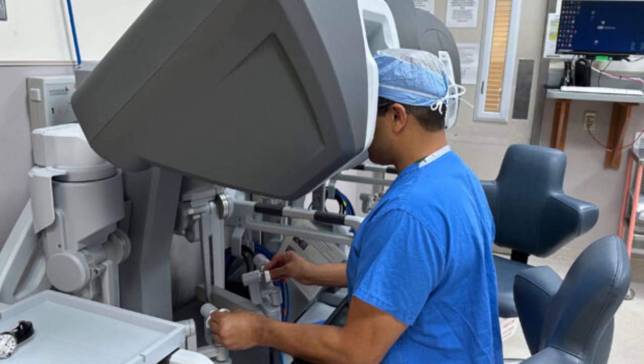A liver transplant traditionally is performed as an open procedure, with a surgeon making a 3 to 4 inch vertical and 12 to 16 inch horizontal incision just below the rib cage to remove a patient's diseased liver and place the healthy donated liver. There has been a push by transplant surgeons to shift the procedure to one that is minimally invasive, with smaller incisions that typically result in less pain and faster recoveries.